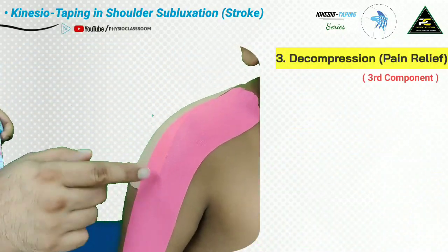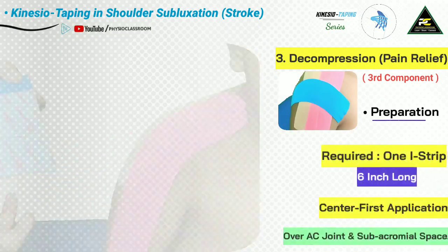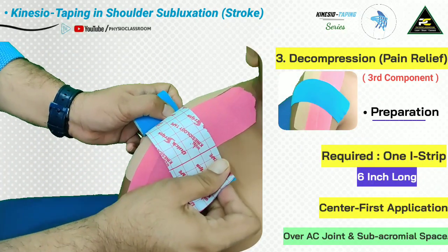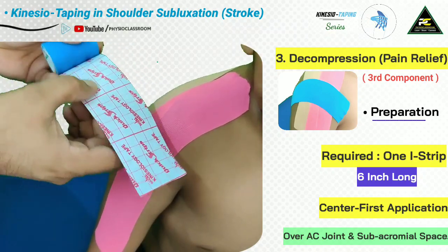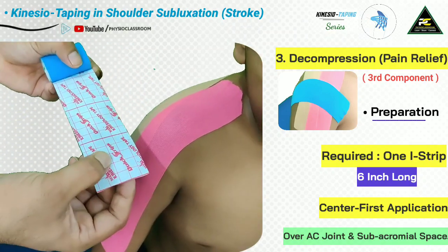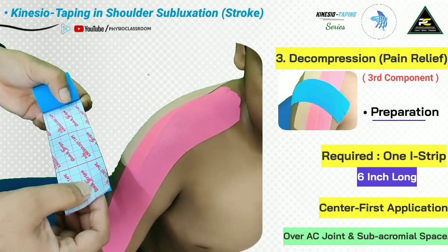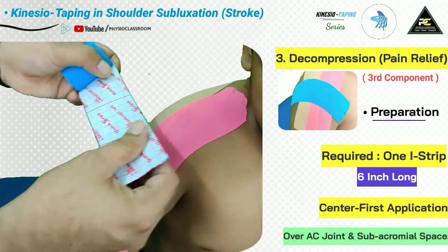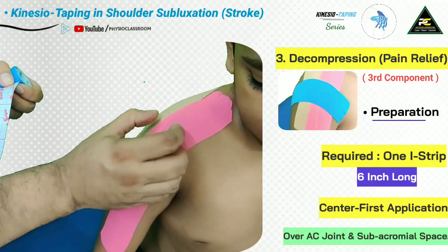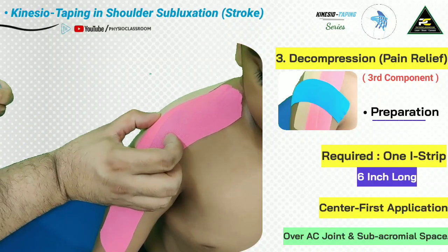For the third application, we address the site of pain using decompression taping with a center-first application method. A six-inch long I-strip is needed, applied so that the tape covers the AC joint as well as some portion of the subacromial space.